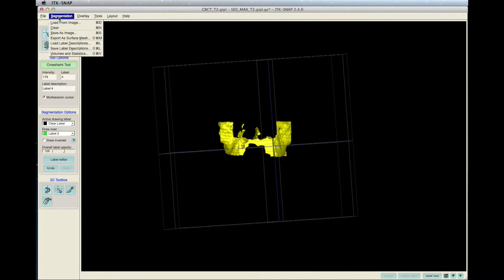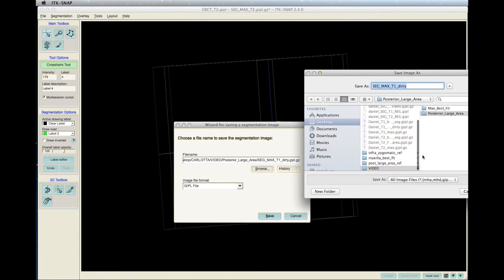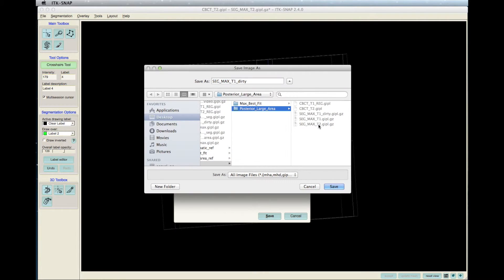When finished with all the cuts, the segmentation is ready to be saved. Go to Segmentation on the upper left corner and select Save As Image. Choose a directory and remember to type .gipl.gz at the end so that it can be saved as a compressed file to save some space.